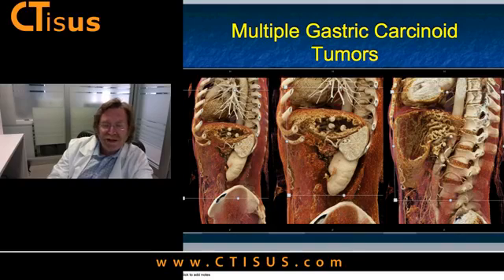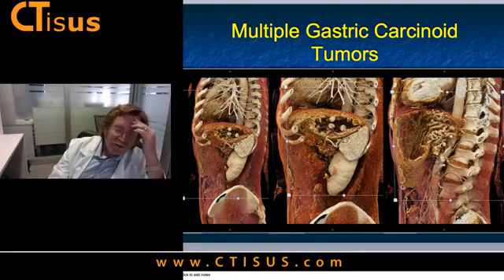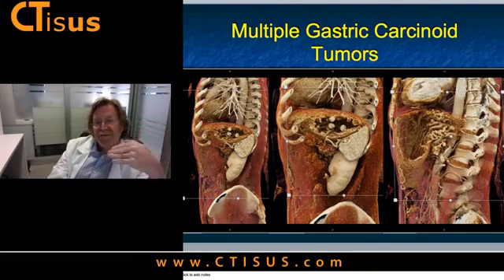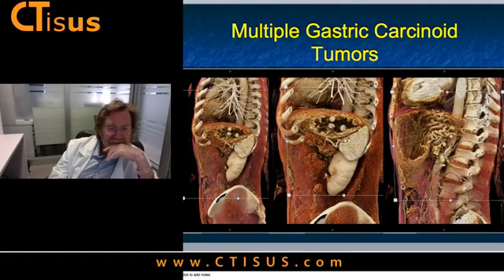I think there is a lot of interest, and I know surely when we submit papers, the reviews have been generally very strong, because the images just have a way of taking your breath away, because they look so photorealistic, and it looks like what you might expect to see. And again, when you talk about 3D imaging, accuracy, fidelity, all of the things, that one-to-oneness between the patient and the images, become very, very practical and very, very important.